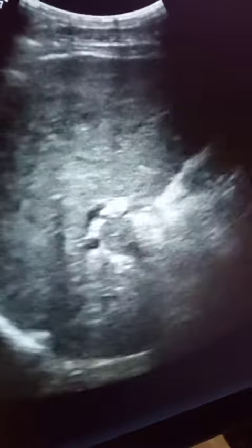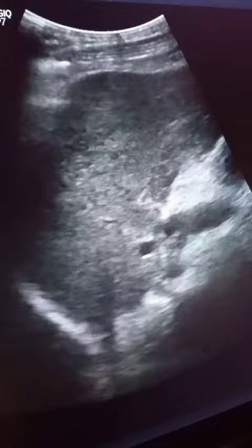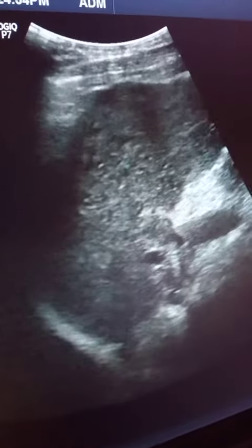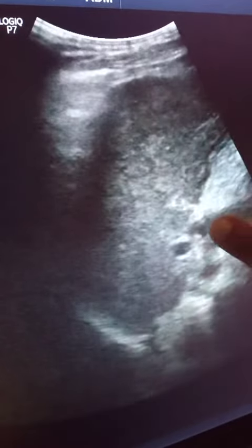On enhanced CT, importantly, the thrombus itself should not enhance. If enhancement is present, then this strongly suggests that the thrombus is not bland but rather represents tumor thrombus, most frequently from HCC.